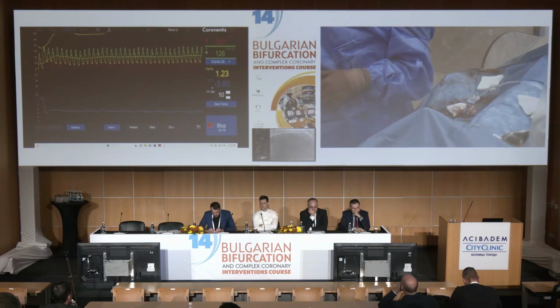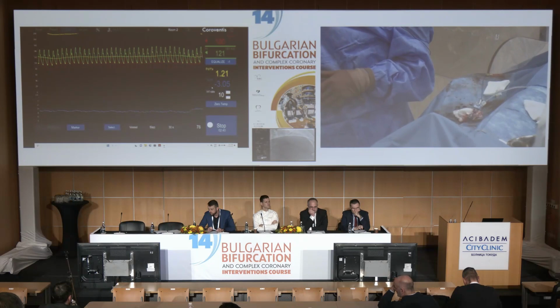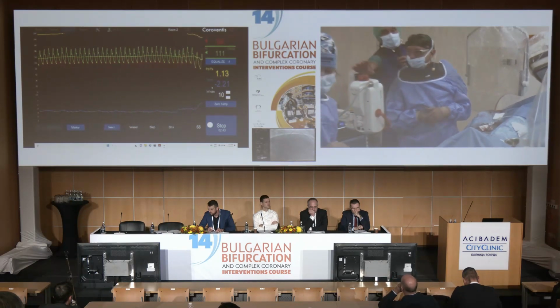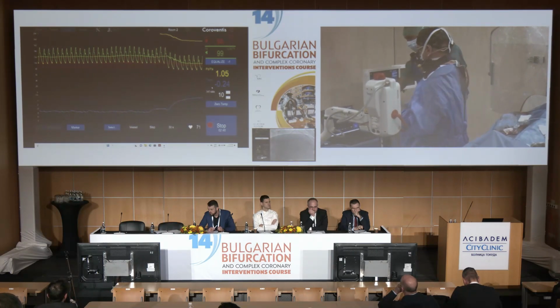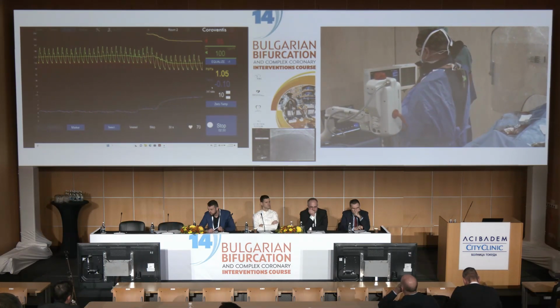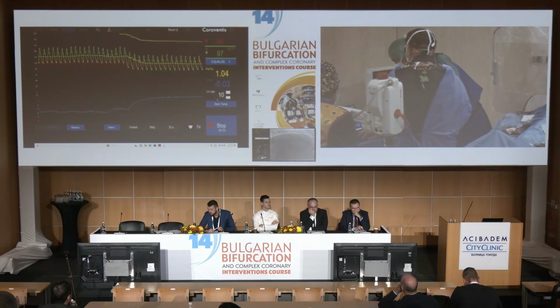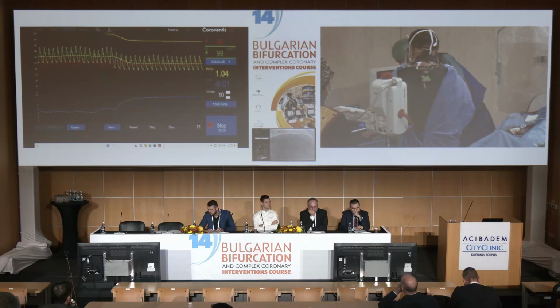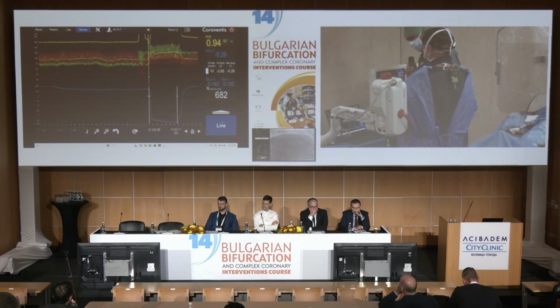And here we are actually done, and I will ask Tabo to stop the pump. And you see that the pump is stopping. And what do you see with the temperature? It goes up, and it will go up to almost 0, you see? And when it reaches 0, we are all happy because this means that there has been no drift. That is 0, and I can stop the tracing. Now, that is it. That is not more difficult than that.